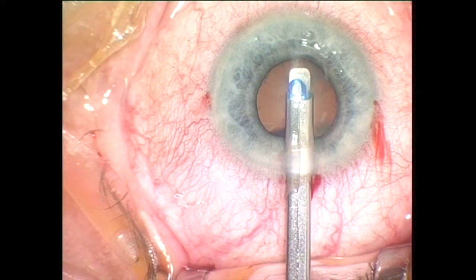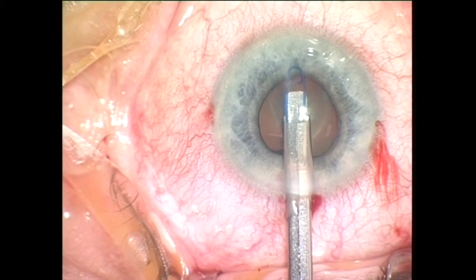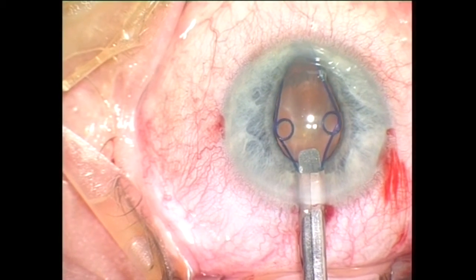Made of 5.0 polypropylene, the device is more flexible and very friendly to the iris tissue. The increased scroll gap makes it much easier to engage the pupillary margin.